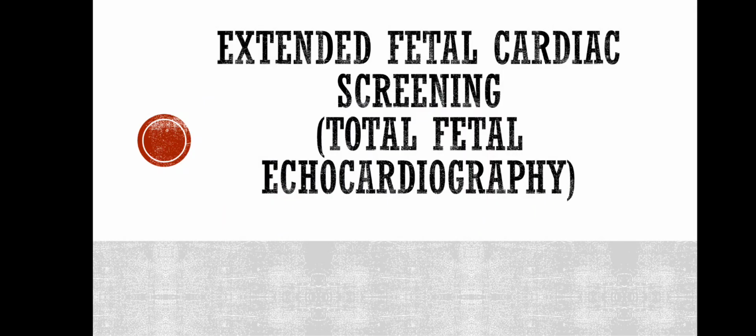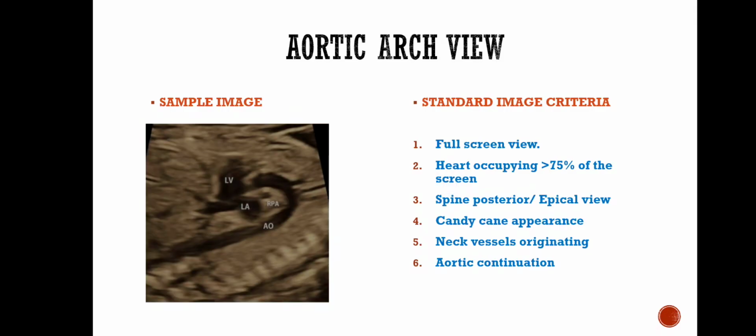Now, extended cardiac screening. Once the basic screening examination is complete, more advanced cardiac evaluation can be performed. This includes the aortic arch, ductal arch, bicaval view, and right subclavian artery assessment. These additional views significantly increase the detection rate of complex congenital heart disease.